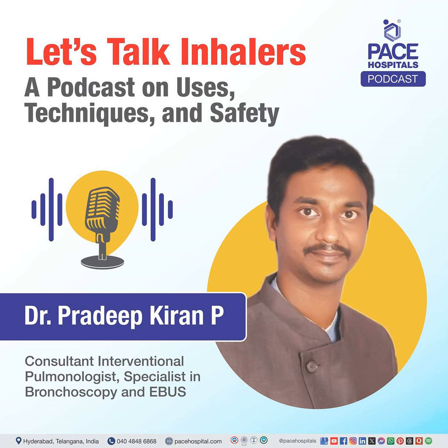Now, where do we use inhalers? Inhalers are primarily used for reactive airway disease. These reactive airway diseases can be COPD, that is chronic obstructive pulmonary disease, or bronchial asthma, allergic bronchitis, and in cases of ILD, that is interstitial lung disease. In any case where there is obstruction to the airway, inhalers are primarily used. The drugs which are used in inhalers are the same drugs which are used in the form of nebulizations also.